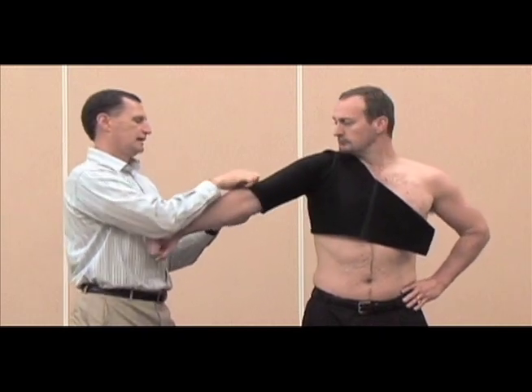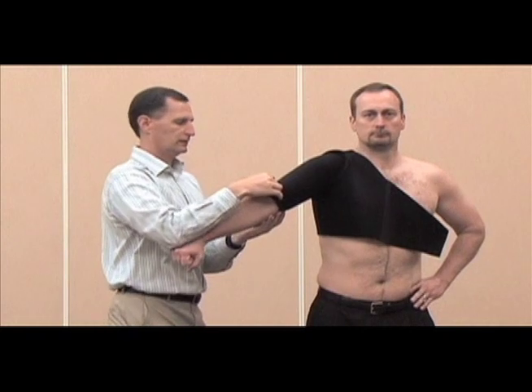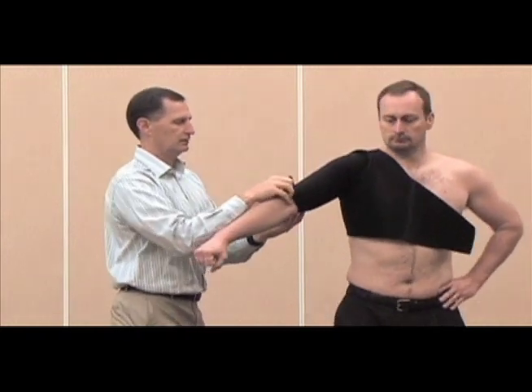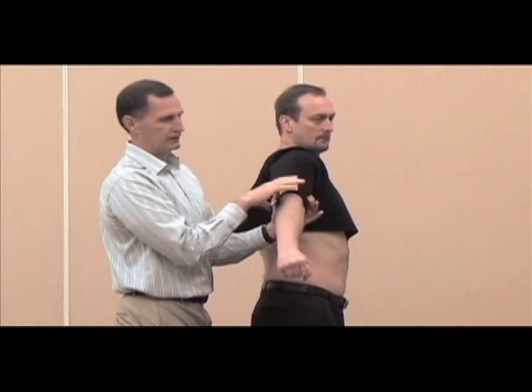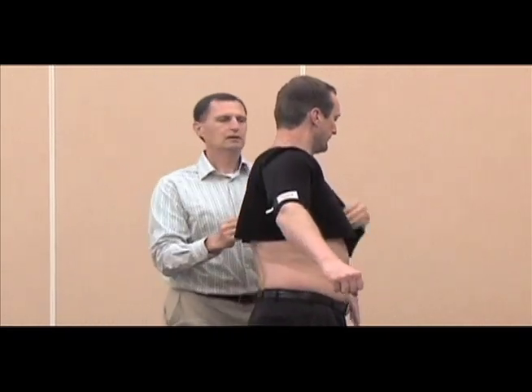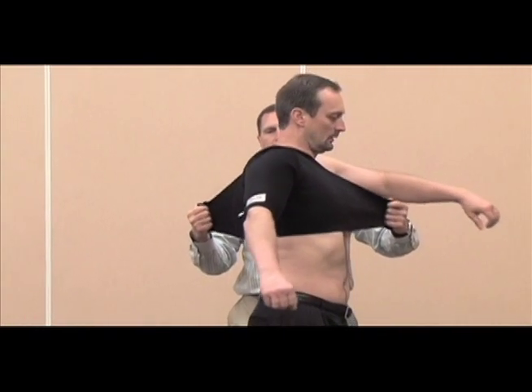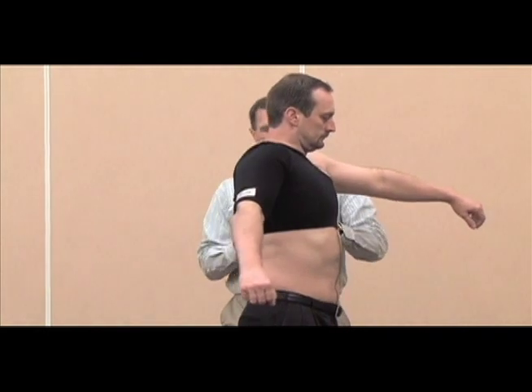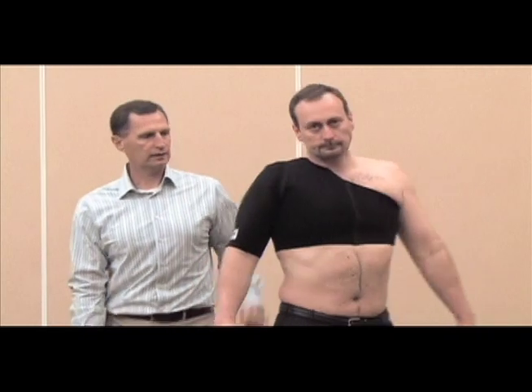Roll the bottom of the sleeve back and secure it. It's not as secure below the bottom of the bicep. Take the stretch out of the material, have the athlete take a deep breath, fold it, and secure it.